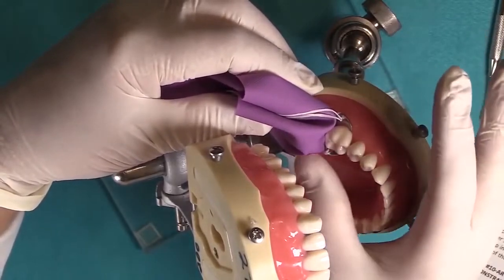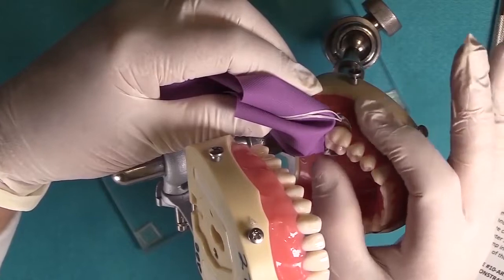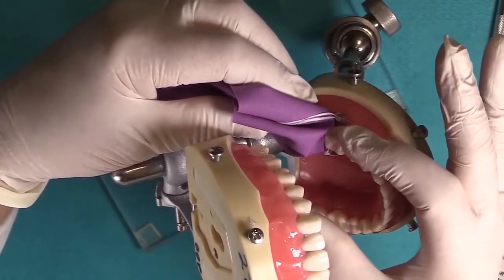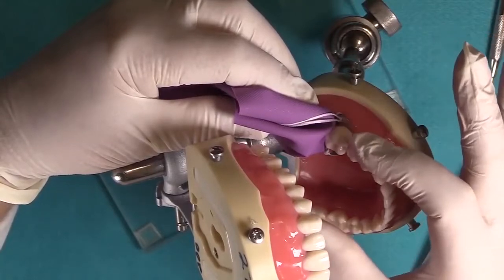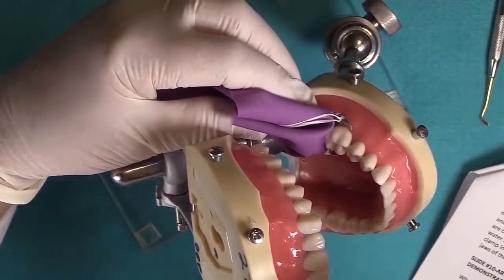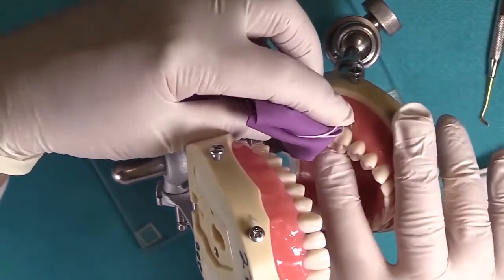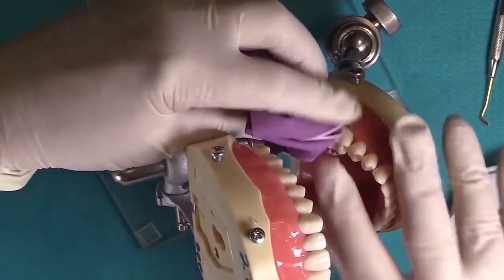So basically, you slide the lingual jaw into position. You open the clamp wide enough to clear the buccal height of contour. Then as you get past the height of contour, you slightly close the clamp so it's sliding along the surface of the tooth and guiding into place. Again, I'm checking to make sure it's stable.